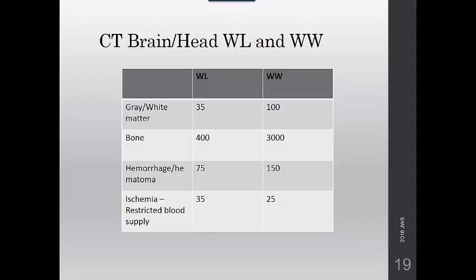75 to 100 milliliters of contrast at 1 to 2 milliliters per second is routinely used, and a scan delay of 5 minutes is long, but most facilities begin scanning after 1 to 2 minutes. Pay attention to the scan delay at your clinical sites. Compare it to the others just to give yourself an idea of what's going on.